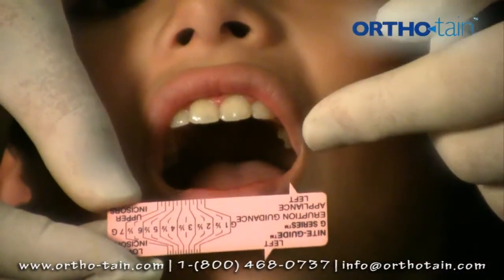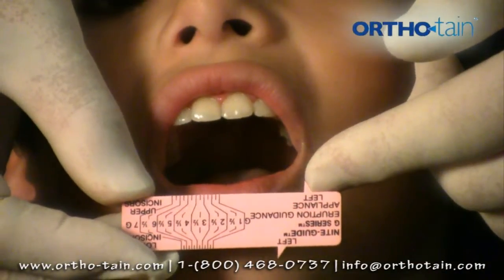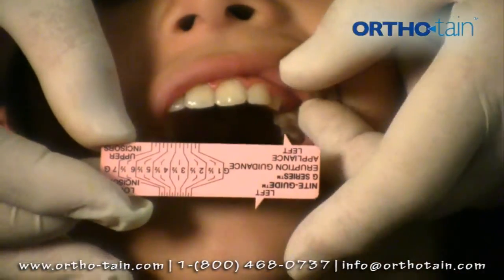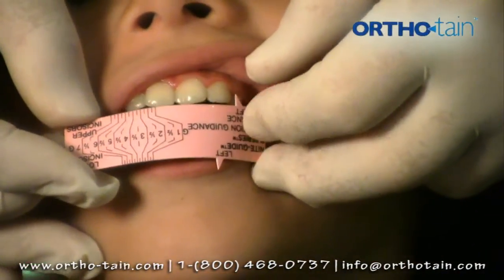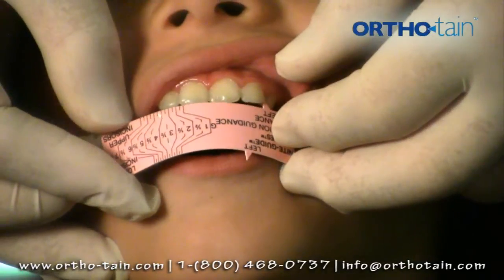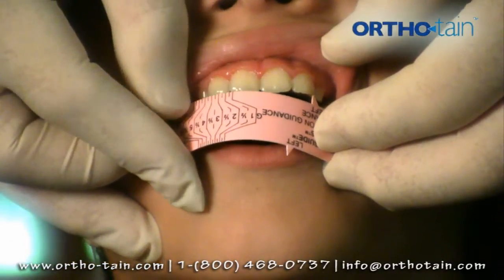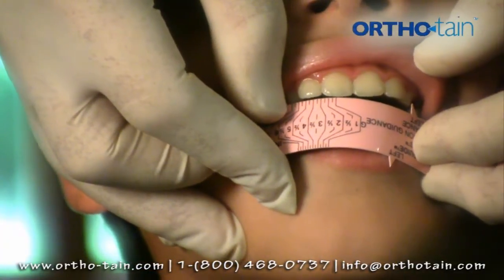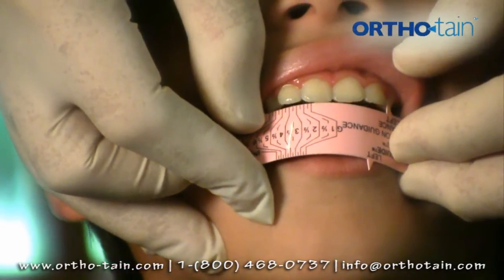We use a pink ruler that has a larger measurement for the upper teeth and a smaller one for the lower teeth. To measure the upper teeth, we place this on the distal of the upper lateral and run it along the incisal edges to the distal of the opposite lateral, and that comes out as five and a half.